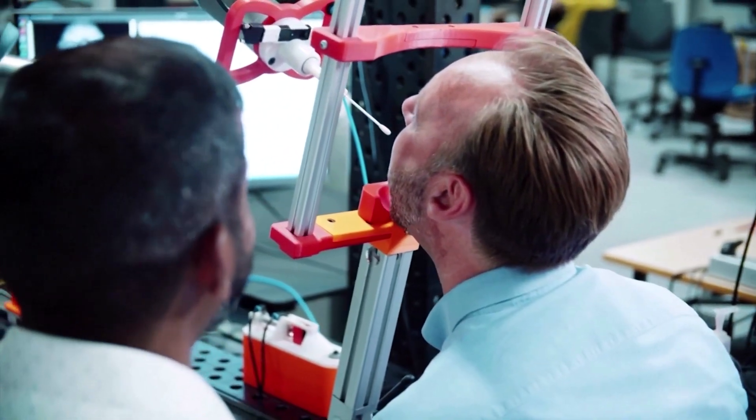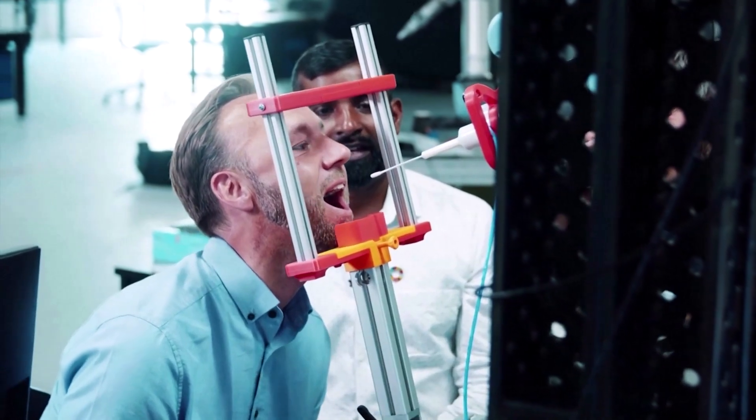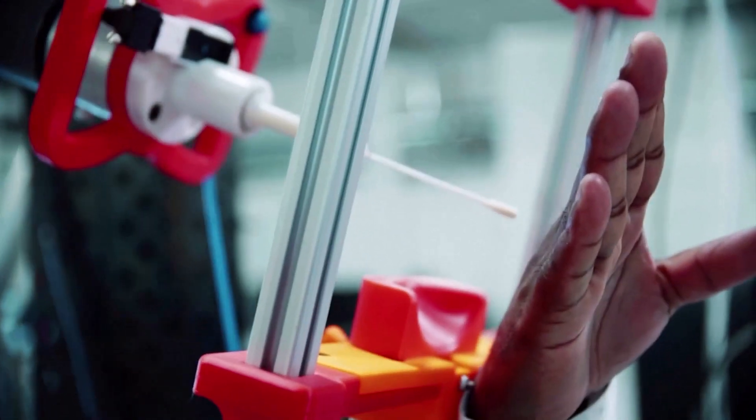The research team said the robot is powered by artificial intelligence. It uses cameras to find the right part of the throat and is programmed to swab it gently.